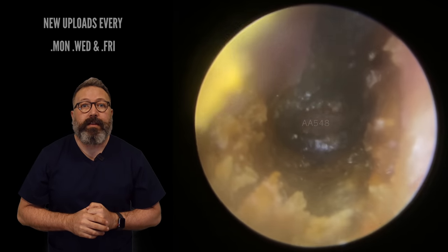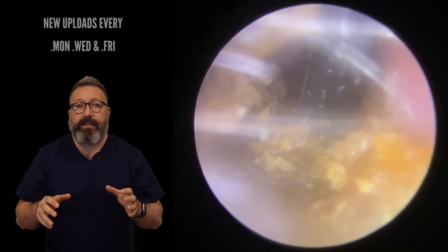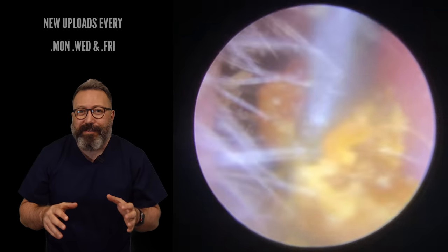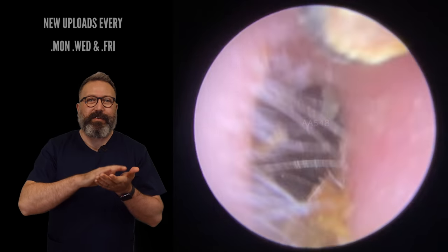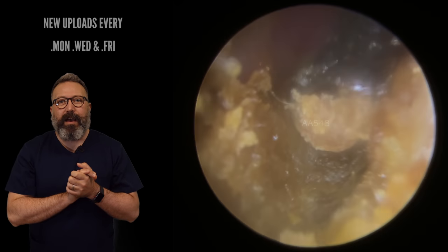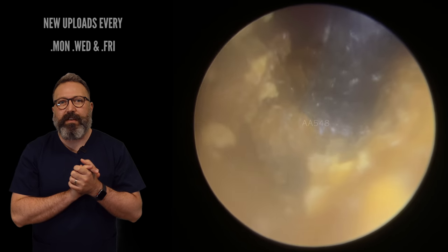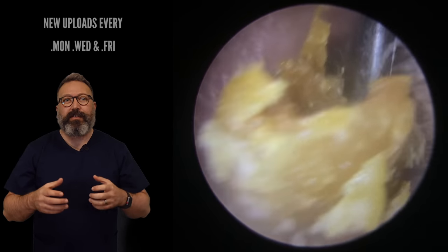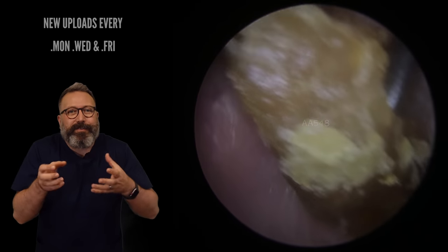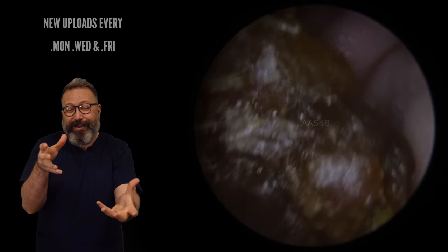We're going to have another go at that now. Here we are trying to press into the harder section — it doesn't look promising. I just scraped over the top. Now, if you've watched Wednesday's video, you know we talk about when it gets quite thin, sometimes we have to switch it up. By the feel of this, I can feel that harder section is almost moving — there we go, that's got it. You can see how that front section started to come forward really quickly. We got hold of that harder kind of husk — I like to call it that. Look at how that whole section came away. That is a big old chunky bit of wax.